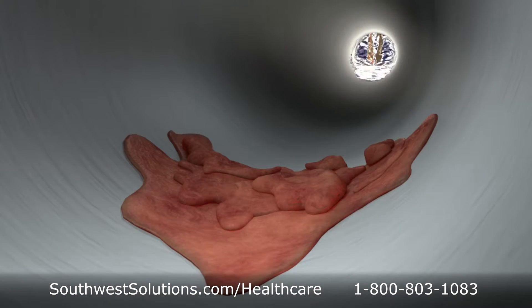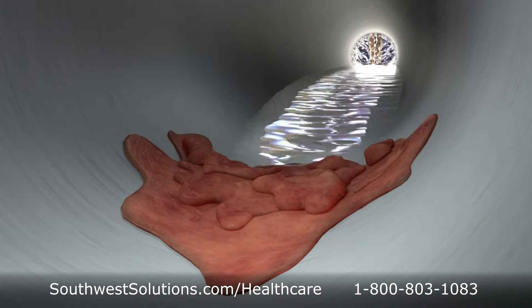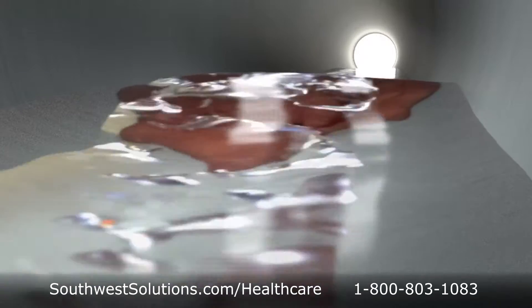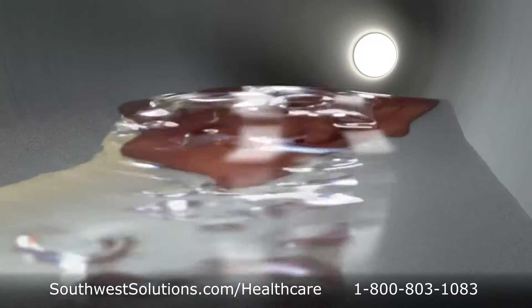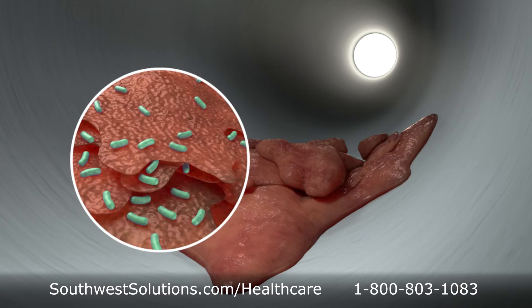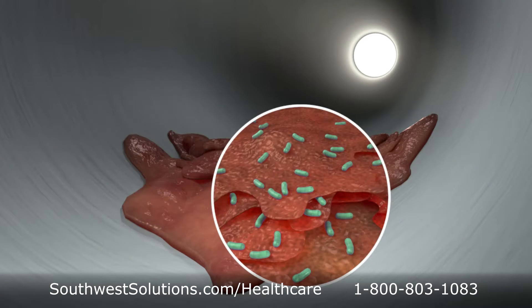A manual washing process could simply rehydrate previously hardened bio-burden, allowing it to detach during the instrument's next use. Bacteria concealed in this residue could slip into the surgical field even if the bio-burden never dislodges.